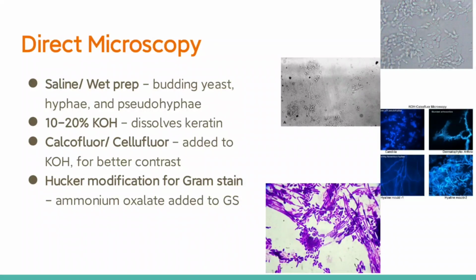Okay? Next, microscopic methods. So, dito, first muna tayo is the direct microscopy. Yung pinaka-basic sa lahat. So, yung dalawang to, okay, saline prep, tsaka KOH, we call them poor contrast. Okay? Poor contrast. Meaning, hindi ganun kaganda or hindi mo masyadong ma-appreciate yung mga fungal elements dito.